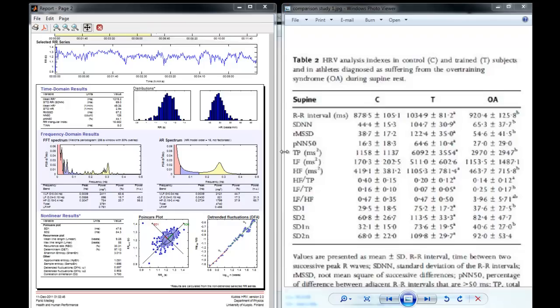So this is basically the initial analysis of heart rate variability. I hope you enjoyed it. It was a little involved, and I apologize I took more than the allotted 30 minutes, but I hope everybody learned something, and I can guarantee you within 5 years this will be mainstream athletic training equipment.